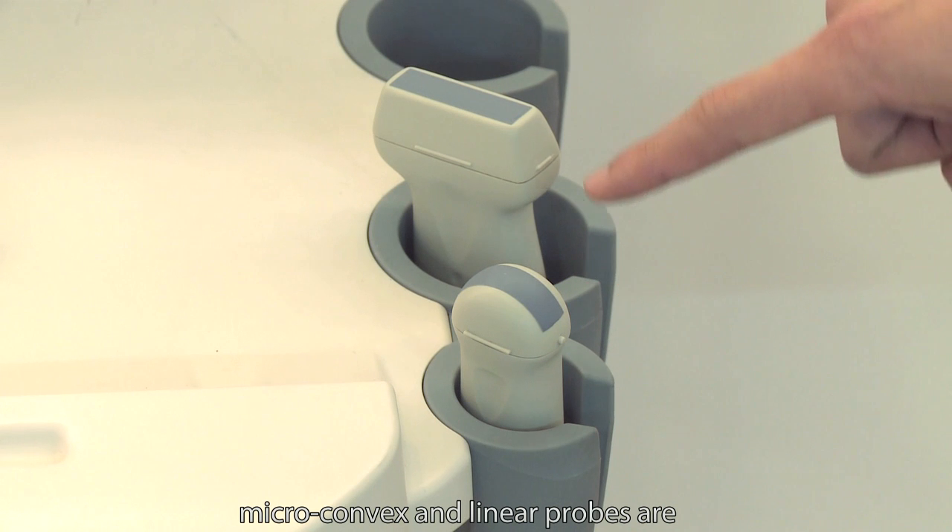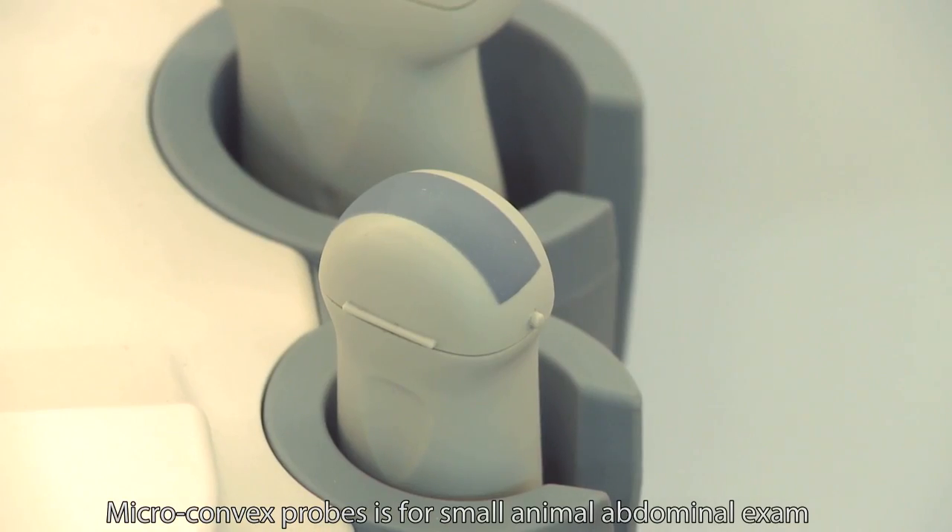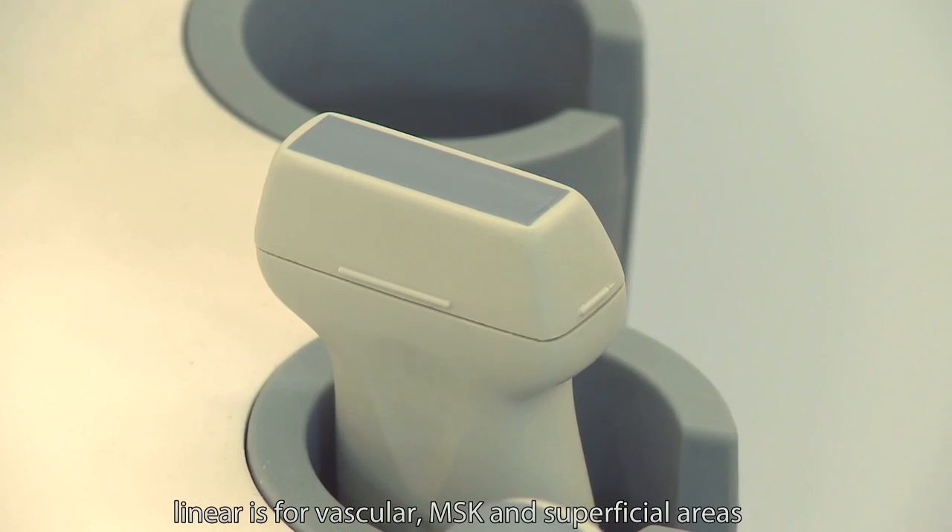Microconvex and linear probes are basic black and white probes for small animals. The microconvex probe is for small animal abdominal exams. The linear probe is for vascular, MSK, and superficial areas.